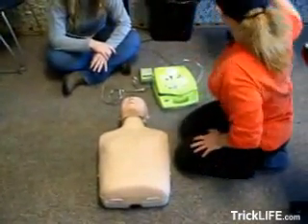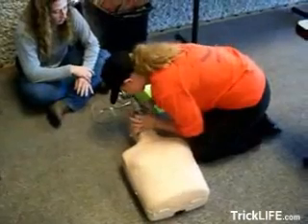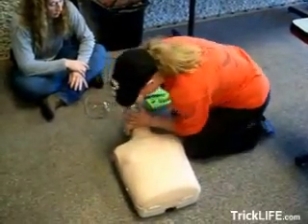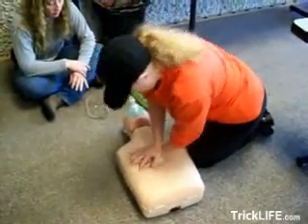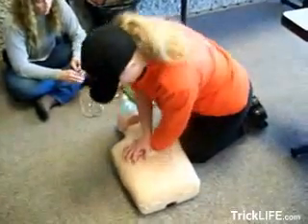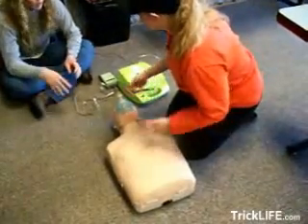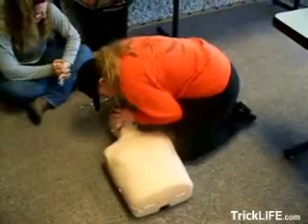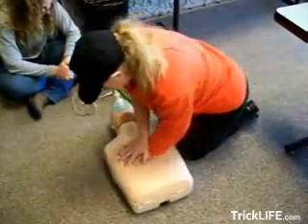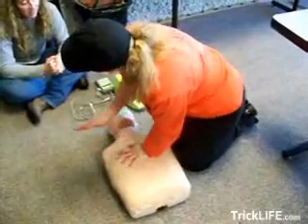She's not breathing, so let's start CPR. Keep going — he was having trouble signing. Okay, he's got the AED, he comes up with it. Do we just stop or keep going until you get to the 30 compressions?